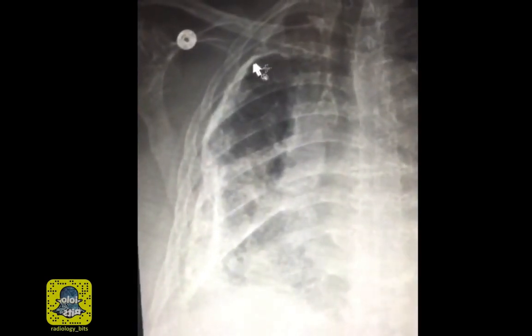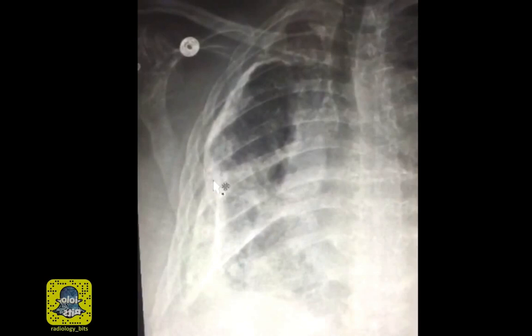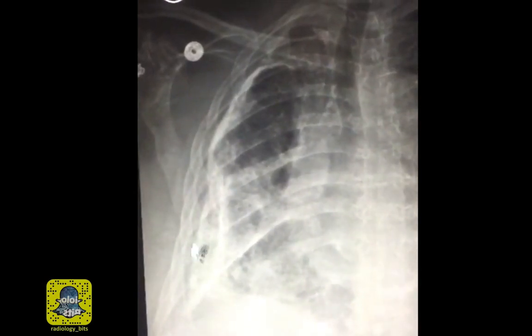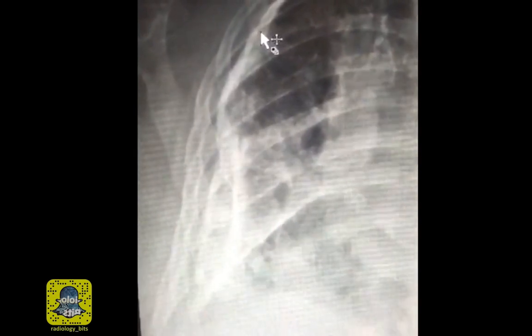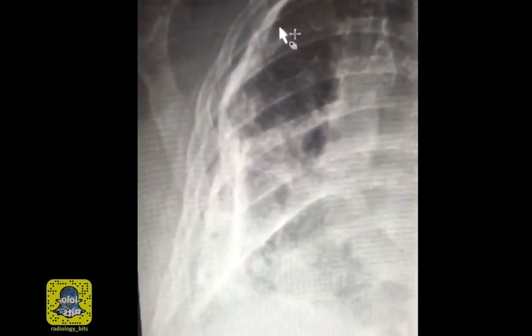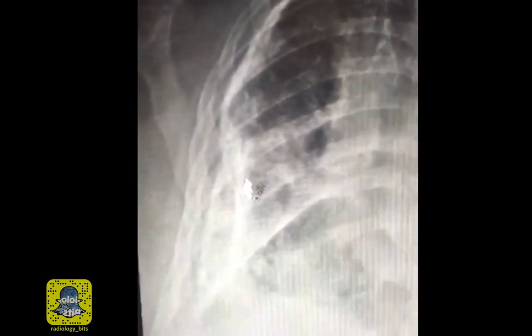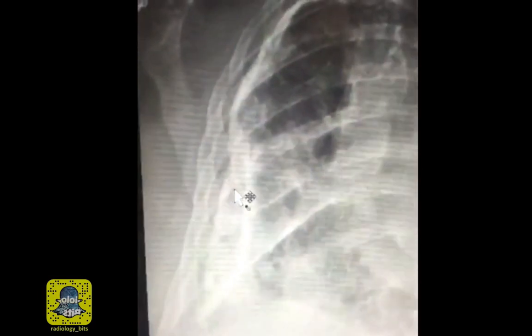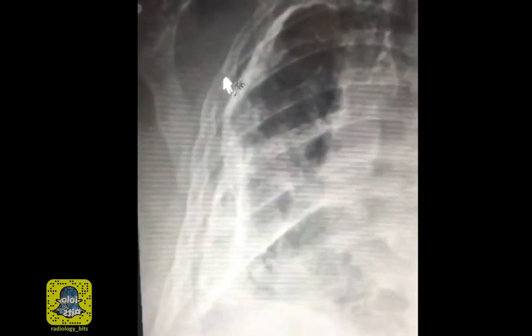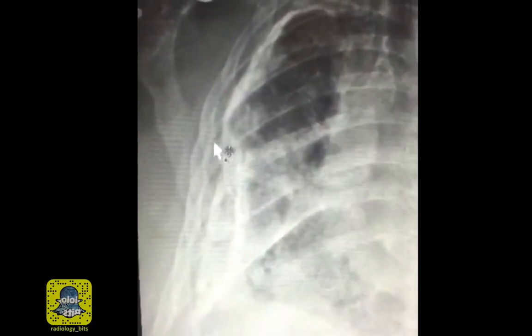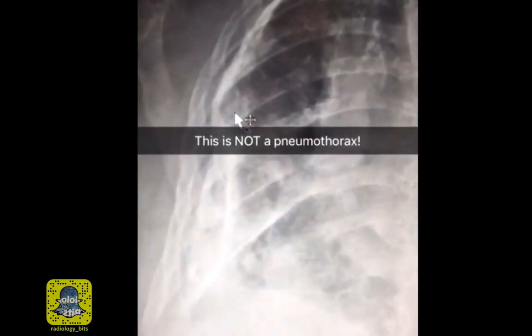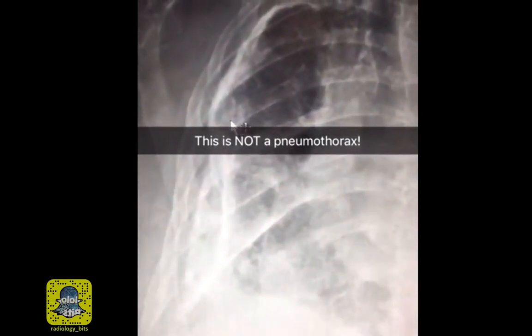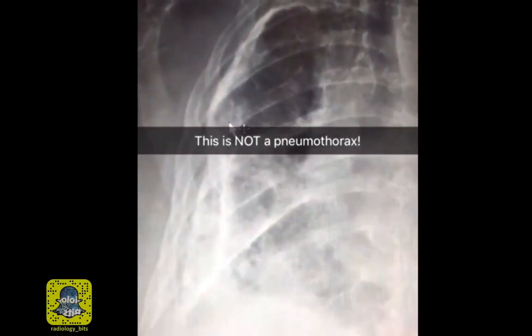The right hemithorax has this relatively smooth wavy line. For the less experienced, you might think that this is a visceral pleural line. You look at this peripheral area and question absence of vascular markings. If you follow that path of thinking, you might confuse this for a pneumothorax, which is not the case.